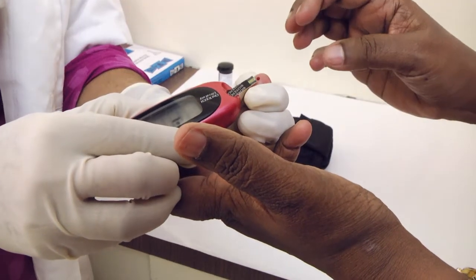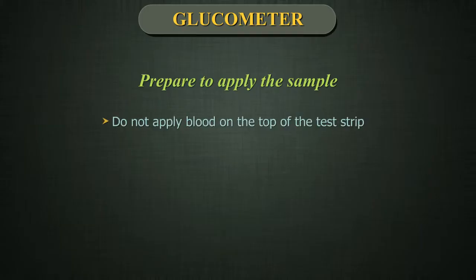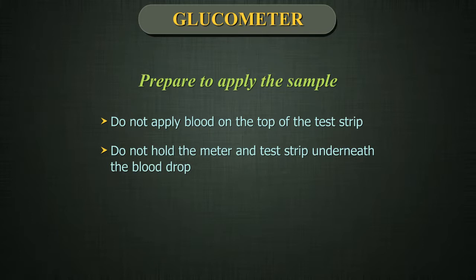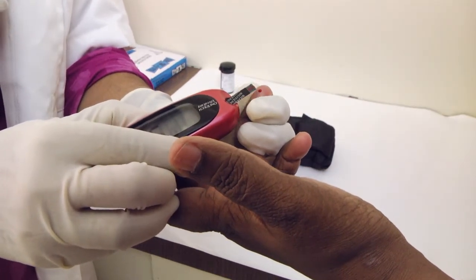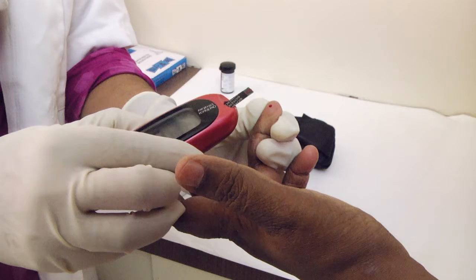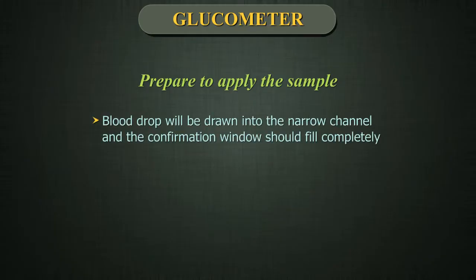Prepare to apply the sample. Keeping your finger extended and steady, move the meter and test strip towards the blood drop. Do not apply blood on the top of the test strip. Do not hold the meter and test strip underneath the blood drop, as this may cause blood to run into the test port and damage the meter. Line up the test strip with the blood drop so that the narrow channel on the edge of the test strip is almost touching the edge of the blood drop. Gently touch the channel to the edge of the blood drop. Wait for the confirmation window to fill completely.